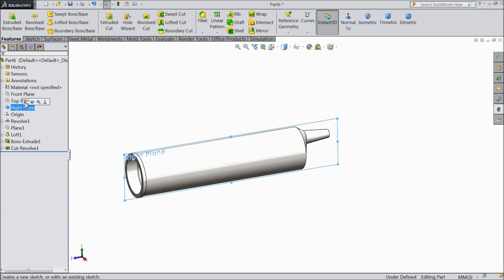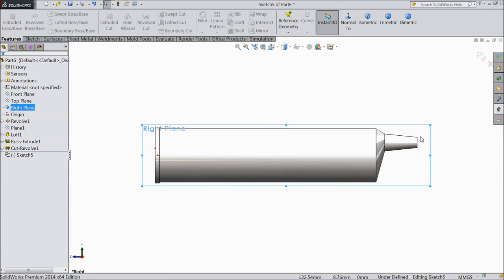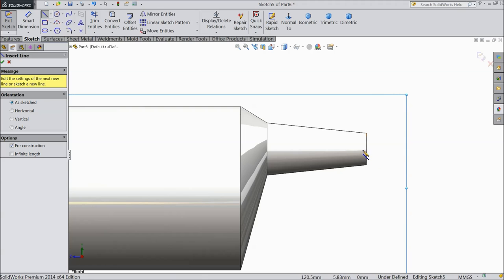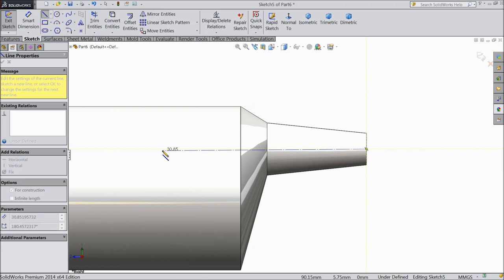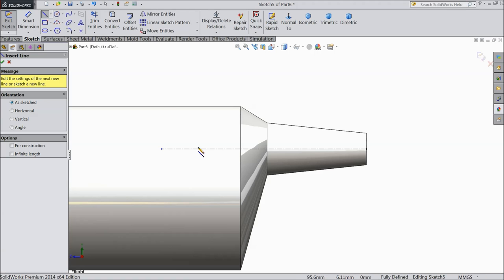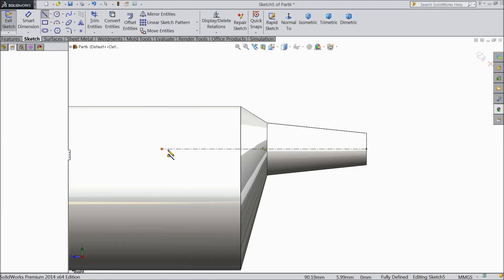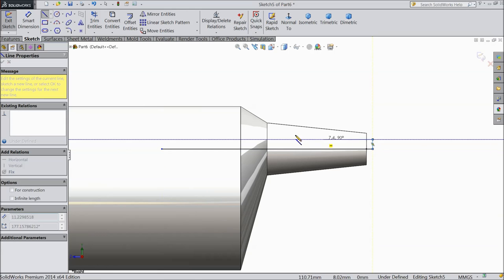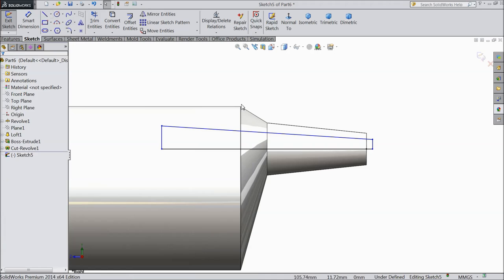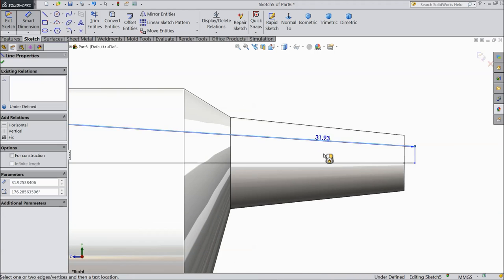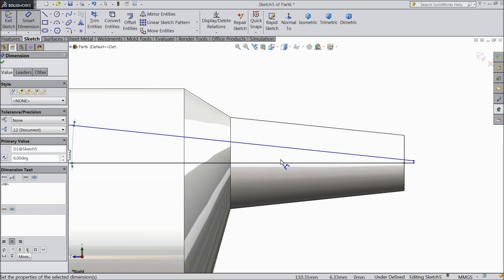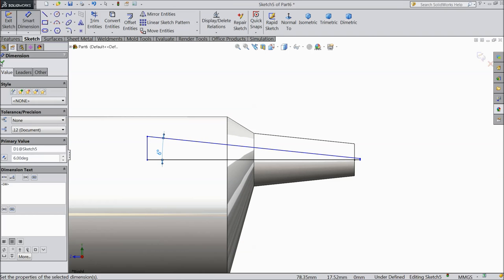Now again choose right plane sketch. We want to cut it from here also. Now choose a line, connect it, then exit. Now let's assign the angle — keep 6 degrees.